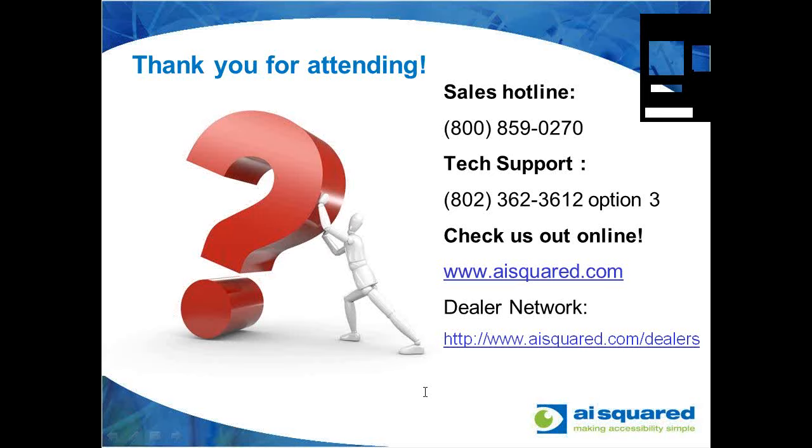Think of it, it's pointing out at your face, so you would have to put the piece of paper or whatever you're trying to look at in front of your face as you're trying to view it on screen. So that would be, as you might imagine, quite awkward to try to peek around the thing in front of your face. So unfortunately, that's not meant for the ZoomText camera. But luckily, these webcams are not very expensive, and a lot of people have them already. So that's the answer to that one.